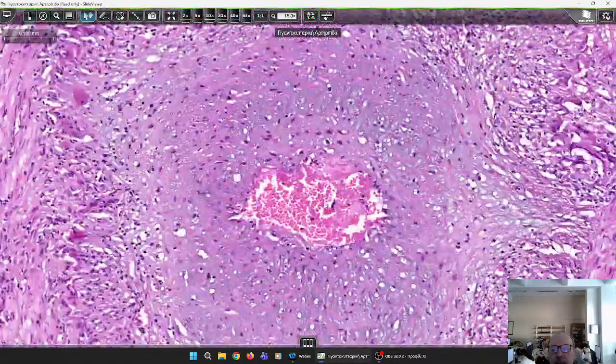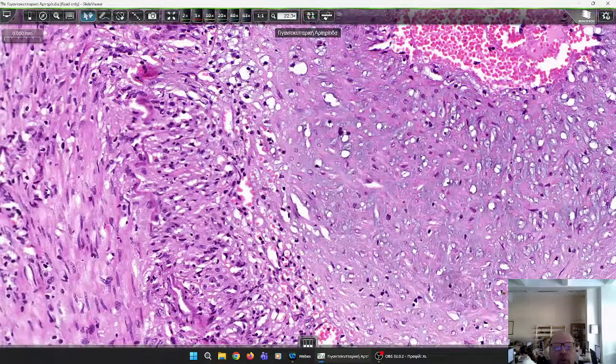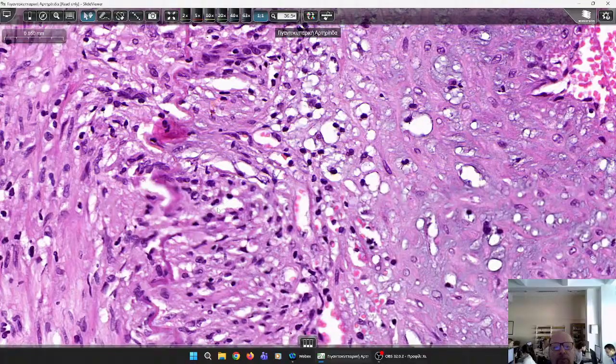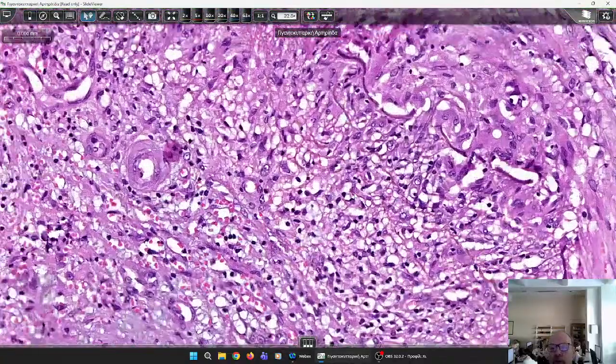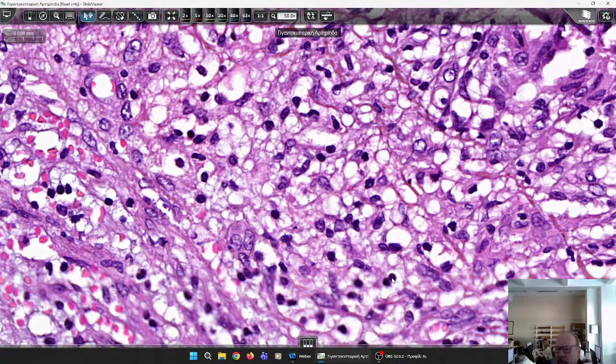So let's have a look. You see all this damaged tissue here, and of course you see the inflammatory cells. If we have destruction of some cellular elements, we may find some neutrophils. However, since this is an immune inflammation, which cell do you expect to predominate? Since this is an immune inflammation, identify these cells, please. Lymphocytes, yes. So it is a mainly lymphocytic infiltration in the wall of the artery.